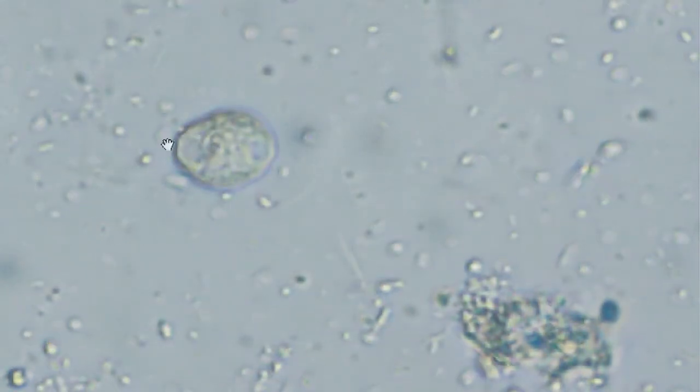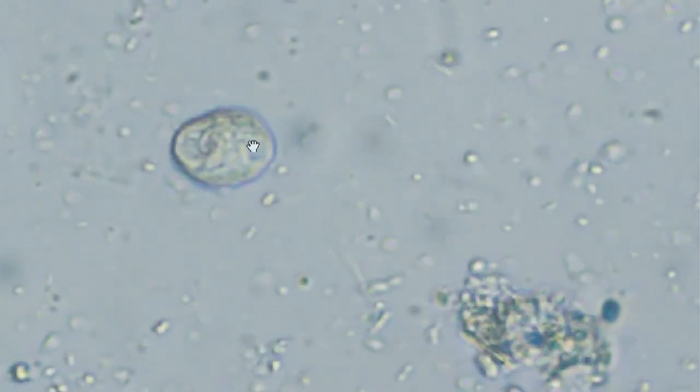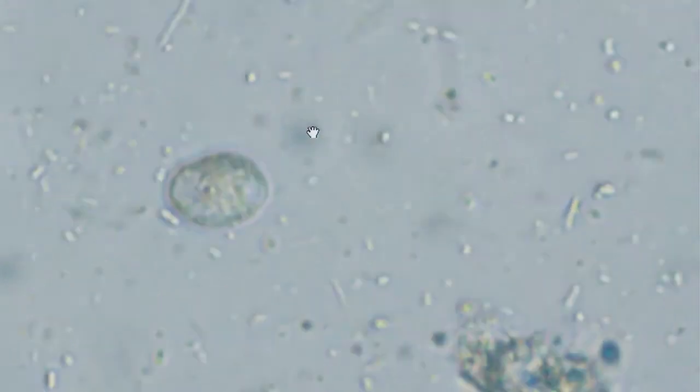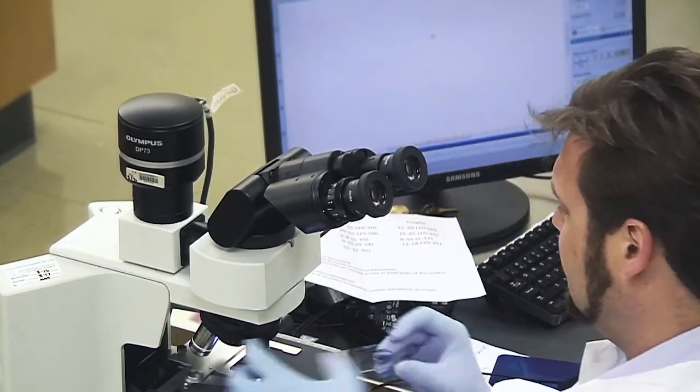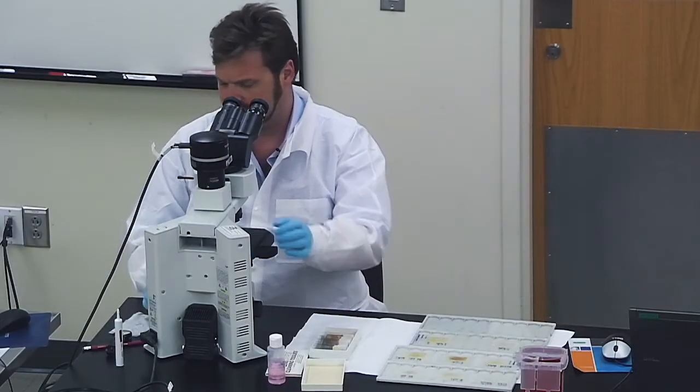This is because it makes viewing the morphology of the nucleus so much easier, and you also have a permanent record that you can show to others or send off to somewhere like DPDx at CDC for us to actually review and confirm your diagnosis. So let's now have a look at trichrome.